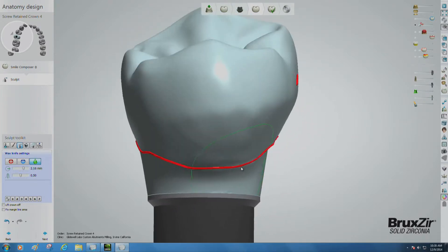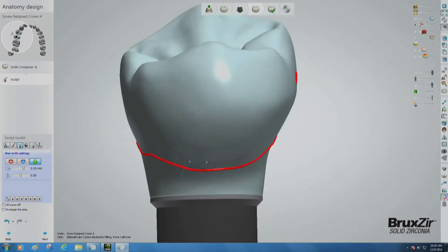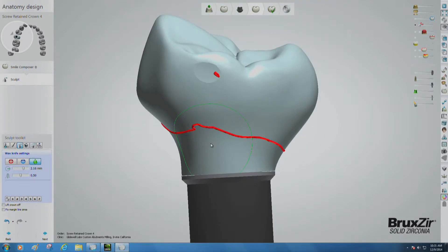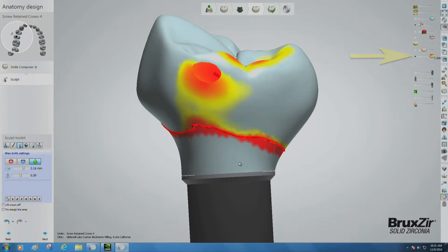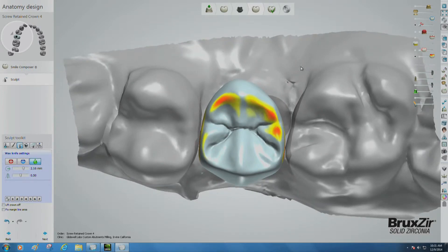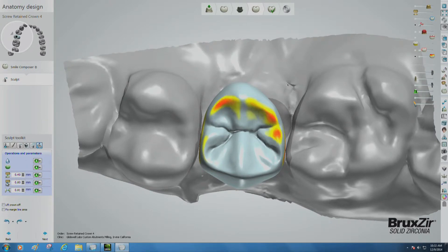Run your cursor over the entire lower third of the crown. On the right side of the screen, there are a series of sliders with small symbols displaying their different functions. Select the slider with red and yellow cusps and slide it all the way to the right. This turns on a distance map that shows warmer colors where the crown is contacting another surface. Go to your sculpt tool kit and switch to the operations and parameters tool. Use the desired distance to antagonist to pull down the occlusal contact points and the surroundings. You can also use precise distance to antagonist to pull only the contact points. Use whichever tool you prefer while correcting the occlusion.